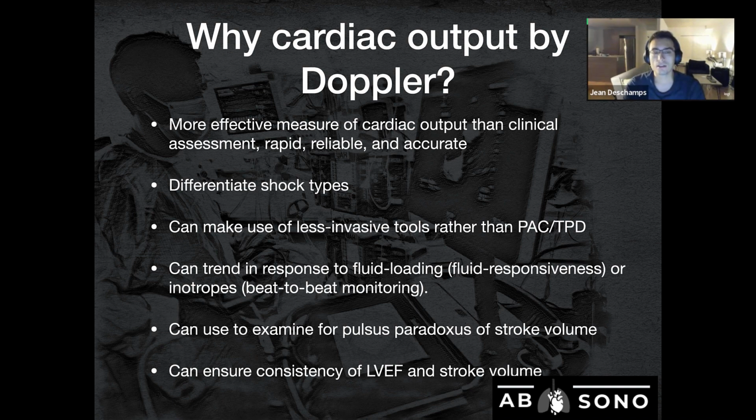I think it's a very helpful method, and it's probably to me more helpful than knowing the EF of the patient, because it's a lot more dynamic and a lot more telling about the hemodynamics of the patient than EF is. Whereas EF can be chronic or acute, the output that's reflected by Doppler actually tells you a bit more about whether or not it works with the patient's condition.